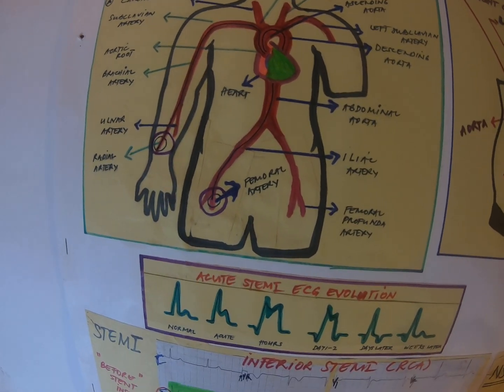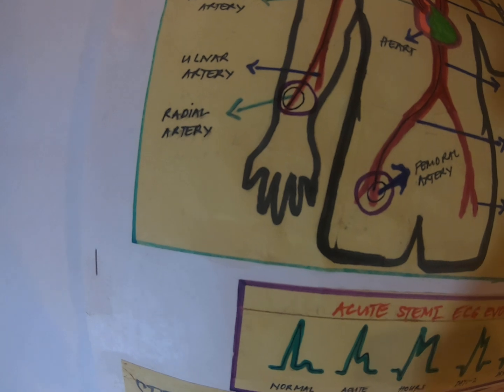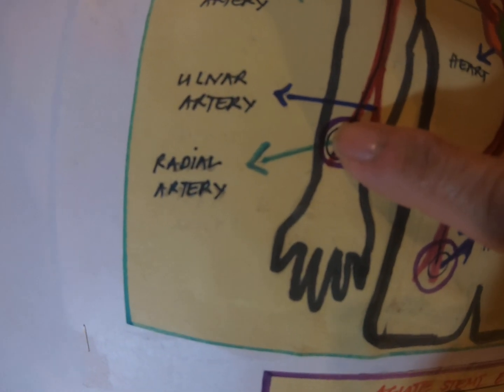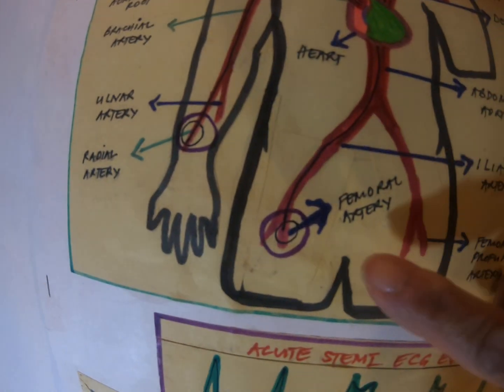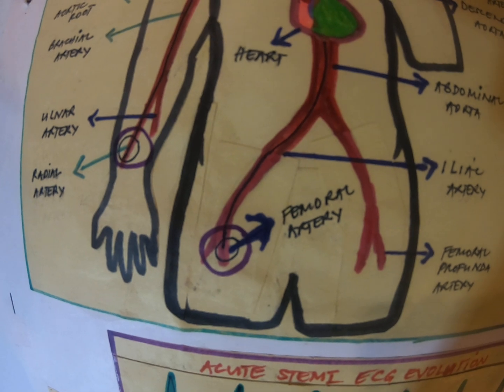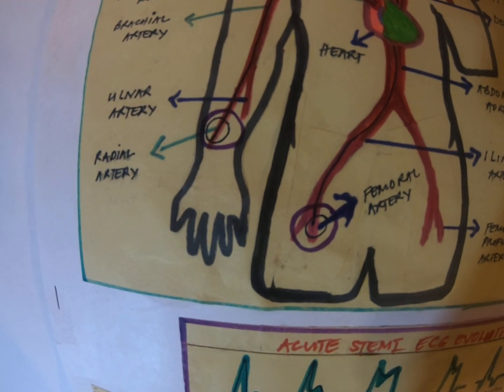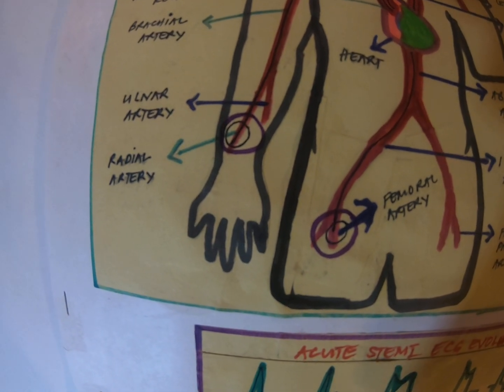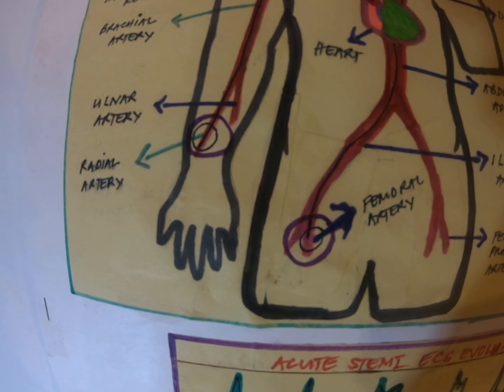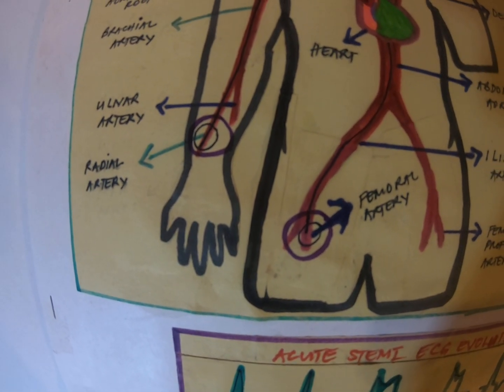Okay, so he can decide whether to get into the radial artery, right here. That's the radial artery here. Or femoral artery. So the things needed for the procedure, they use a local anesthetic, big needles, small and long guide wires, coronary catheters, balloon catheters, and mild sedation, as the patient will be awake.